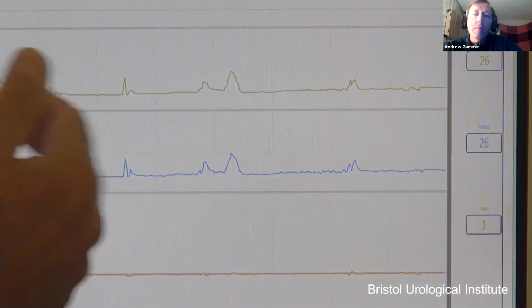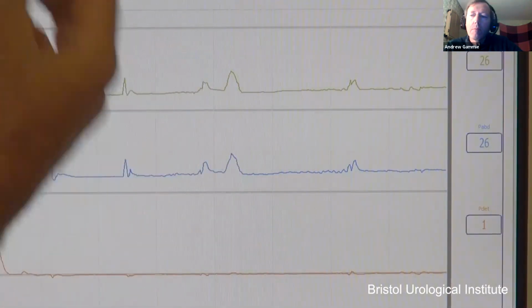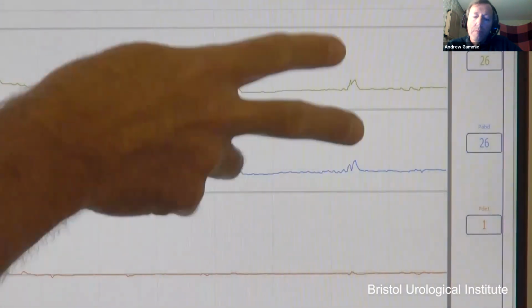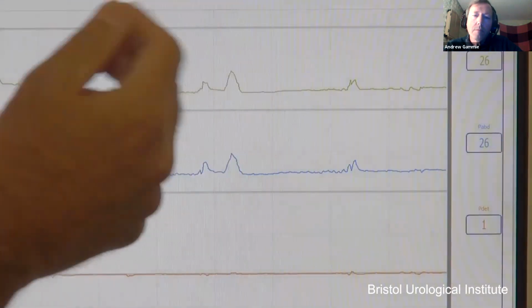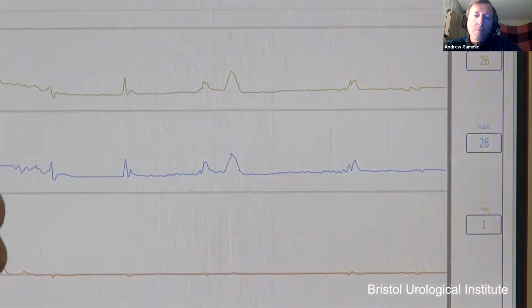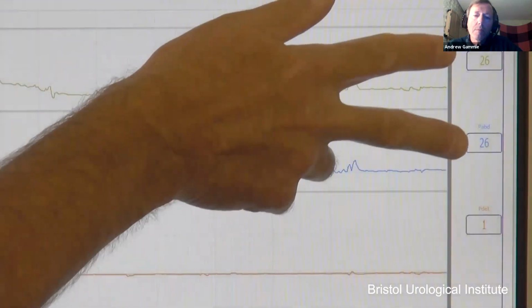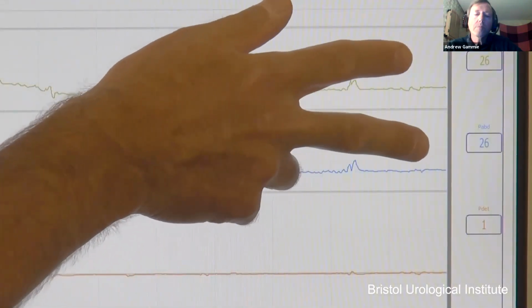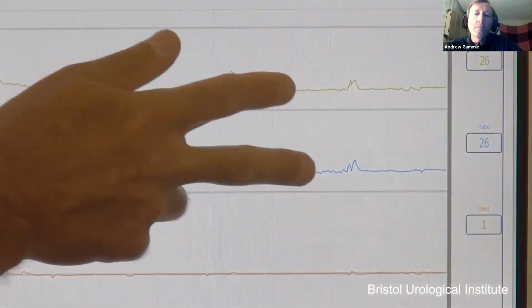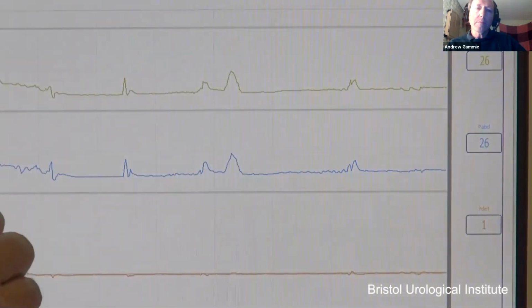And throughout the study, we would ask that the patient does a small Valsalva or exhalation and another cough, probably every minute or 2, so that we can verify that pressure is being picked up still. And throughout, we would also measure those other tests of quality, the resting pressures and the live signal. If those continue throughout the test, you're confident of a good quality recording.